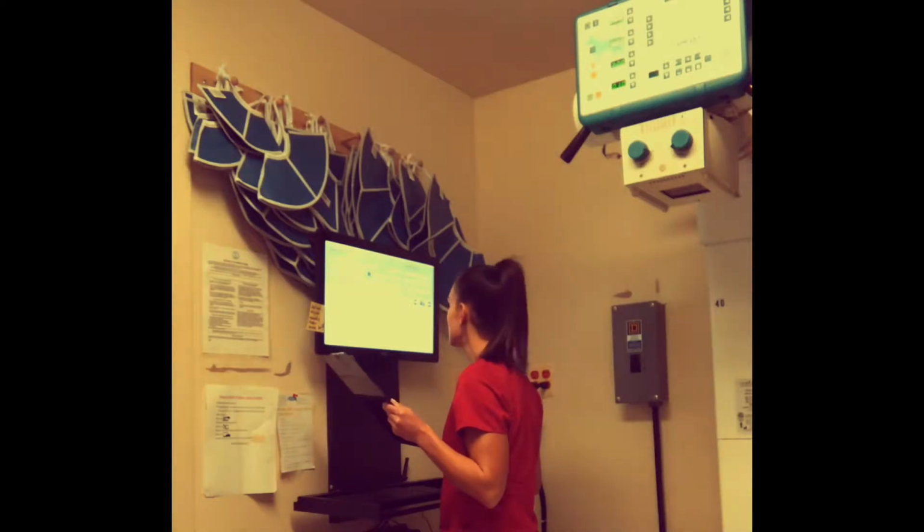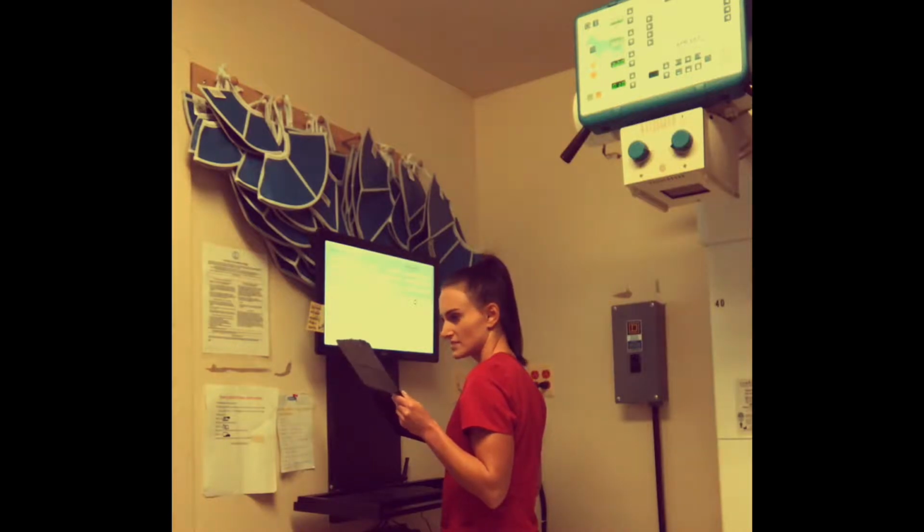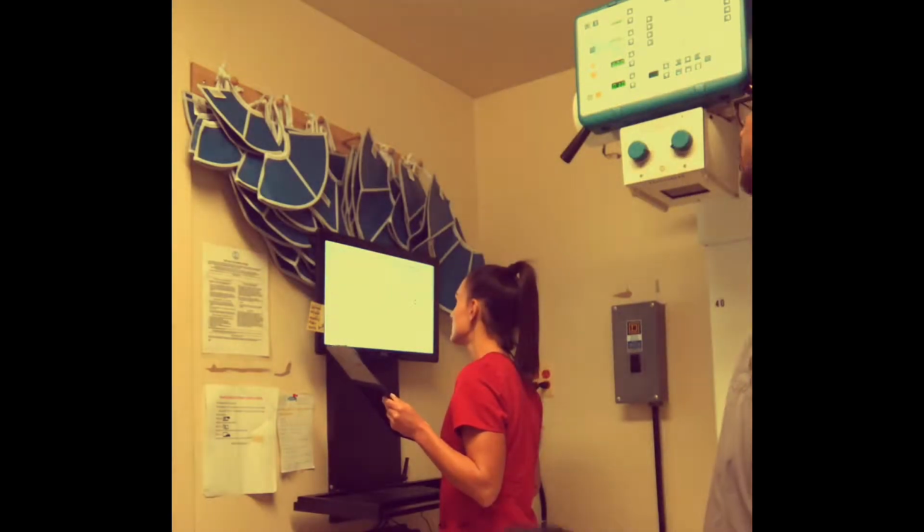Medical conditions that may lead to abdominal radiographs include lethargy, abnormal urinating or defecating, vomiting, diarrhea, appetite loss, and abdominal pain.